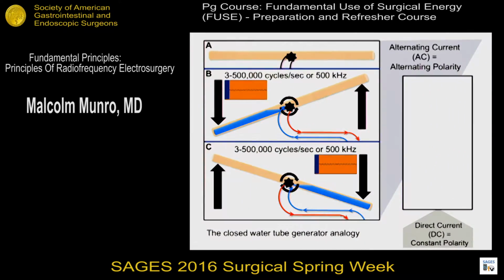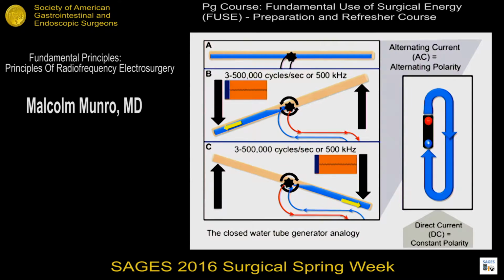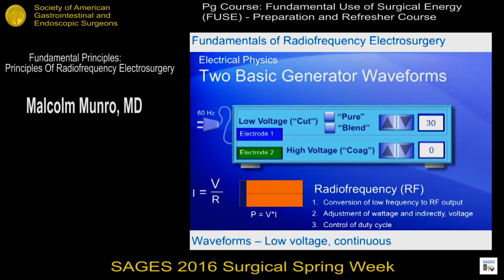And here's another way just to tie these together. So we fill that up with fluid. We tip it one way. We tip it the other way, back and forth, with no net flow. That's different from the sort of racetrack concept and flow concept that you see with a direct current.